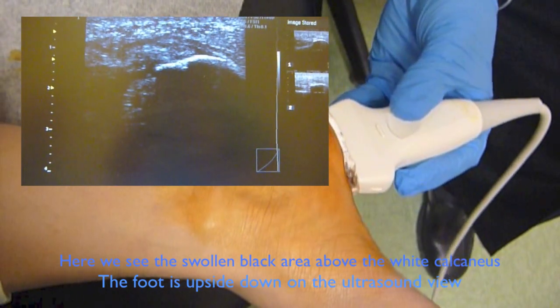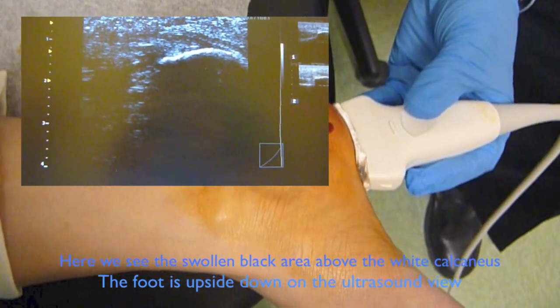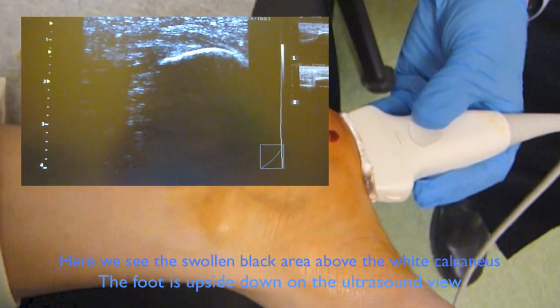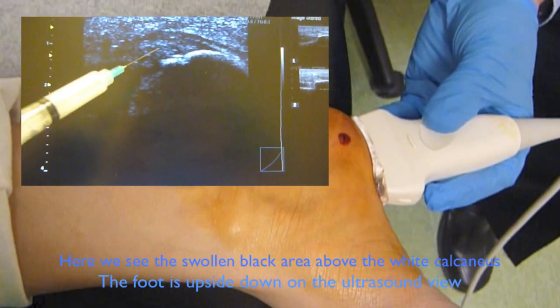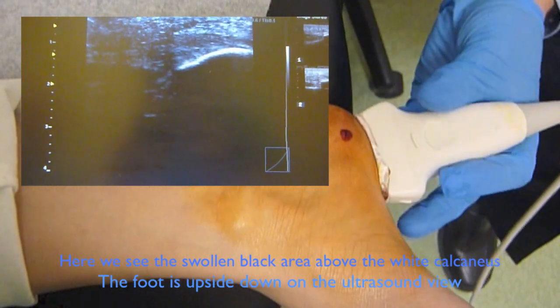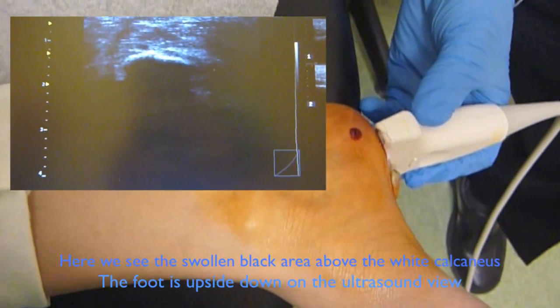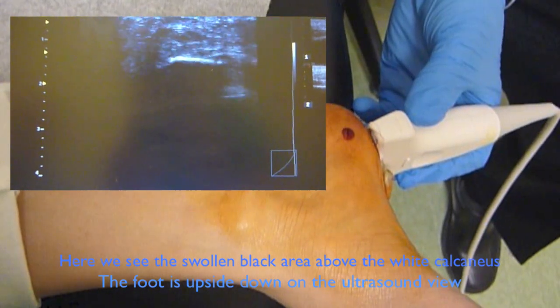So now we're just looking at the plantar fascia and we're seeing the swollen portion where the spur is located. We're going to correlate this, and then I'm going to flip the probe into this direction so that I can follow my needle into the swollen portion of the plantar fascia.